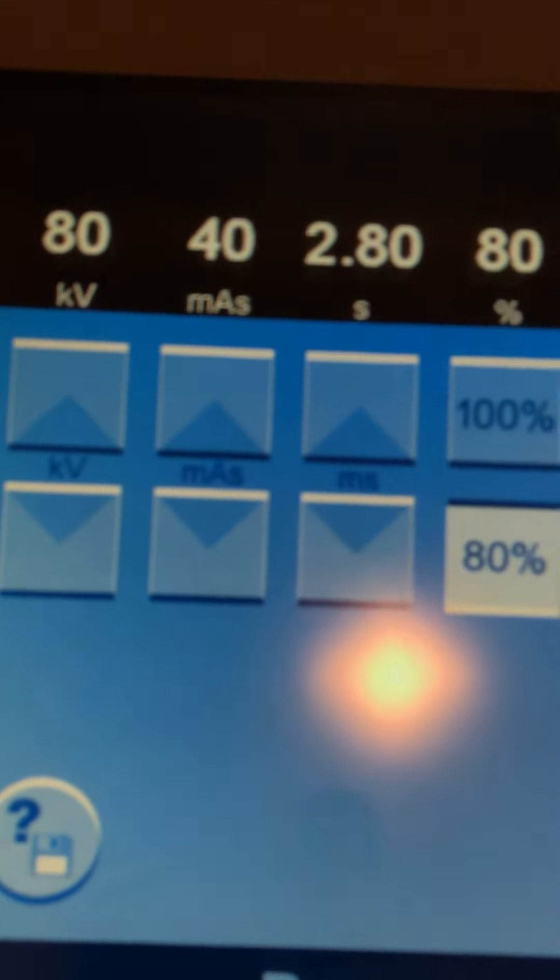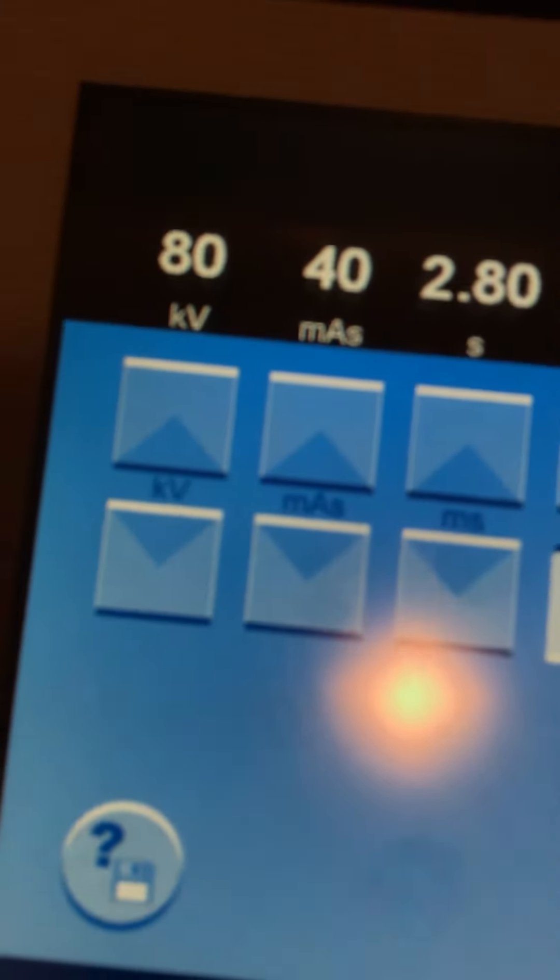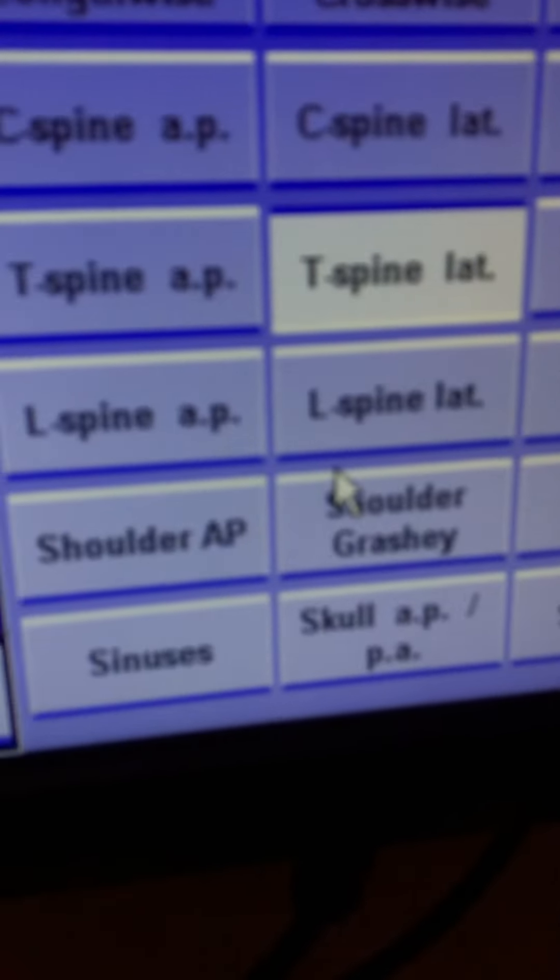This one is 40 at 80 with the breathing technique. The highest this one goes is 2.8 seconds. I'm on the lateral T-spine. There is a grid for this one, 40 to 48 inch distance again. CR is to T7, and the best seen structures are the IVFs.